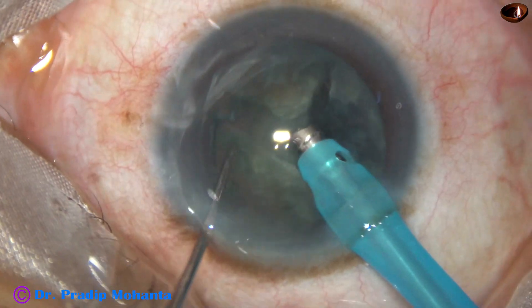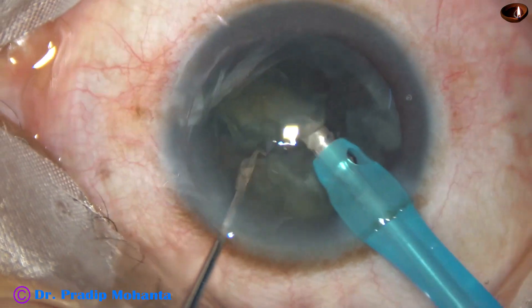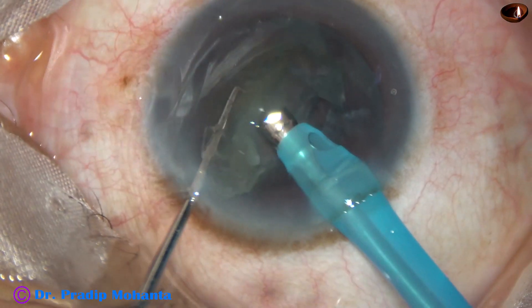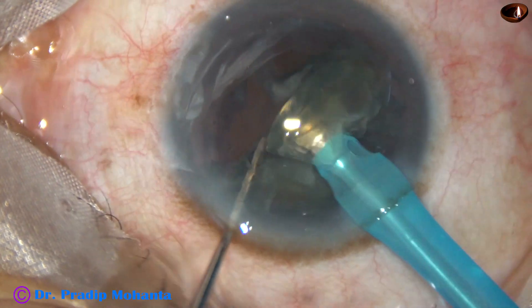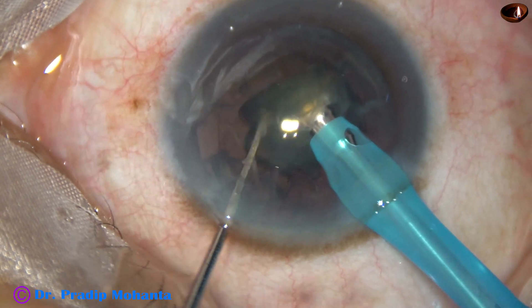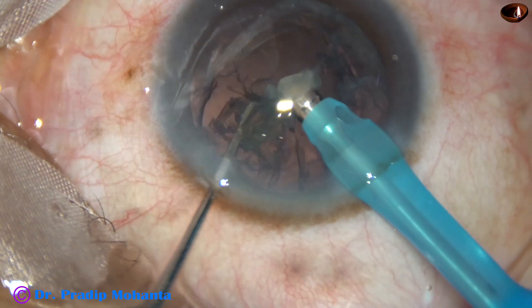And now, the other fragment is subdivided into two smaller parts and they are removed. And this is the other heminucleus — it is divided into two fragments and they are emulsified and eaten up.